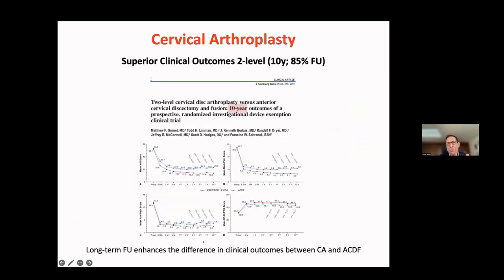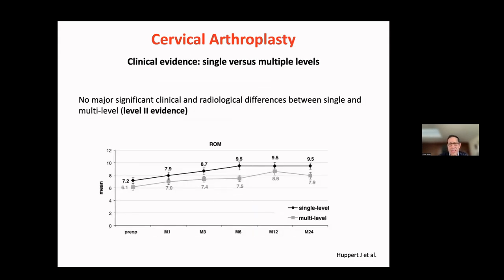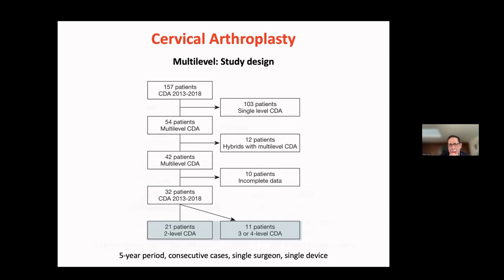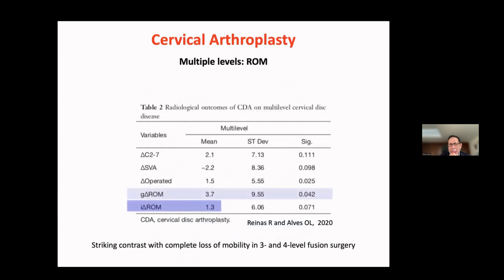Long-term follow-up, the more you follow up the patients, 10-year follow-up, the more you will see a difference between arthroplasty and ACDF, from no major difference in clinical and radiological outcomes when you plot single level versus multi-level. This is a level 2 evidence study. In our study, we have shown also the same. This is a good range of motion, global index level, and this is in stark contrast with fusion.